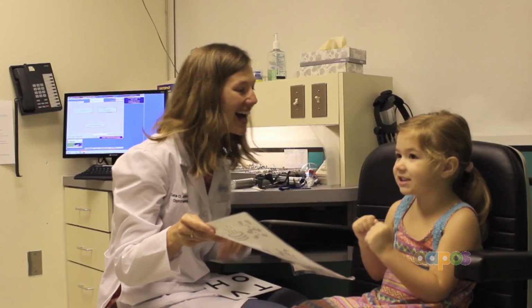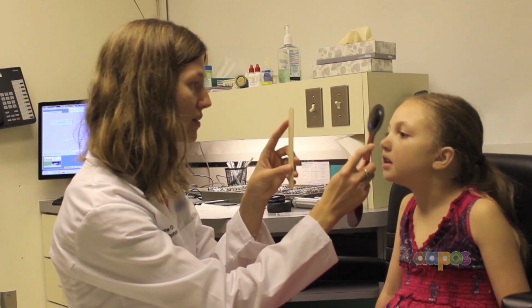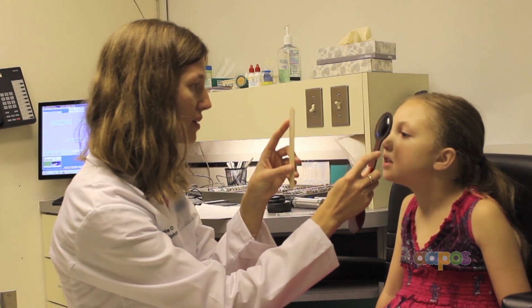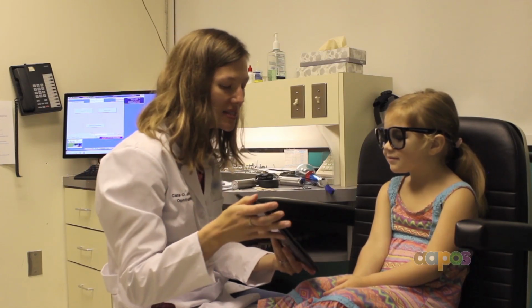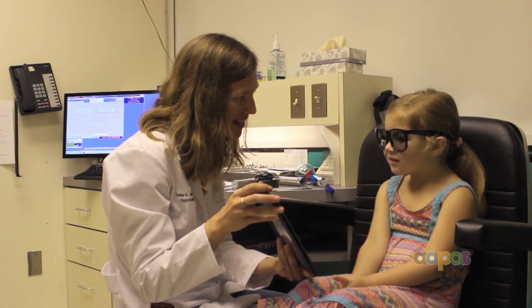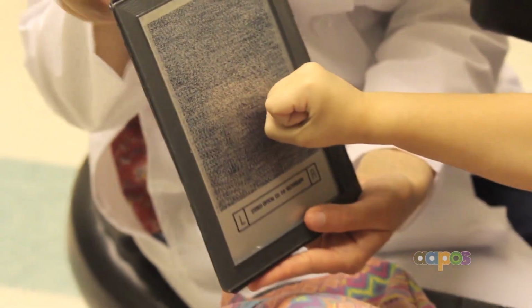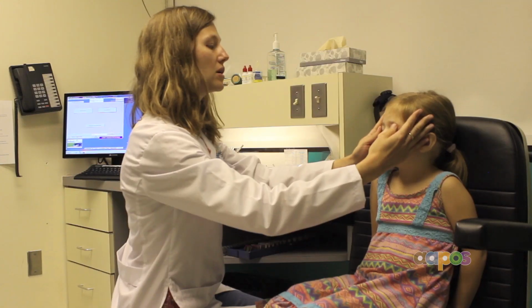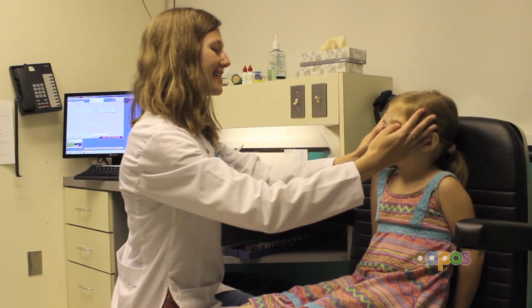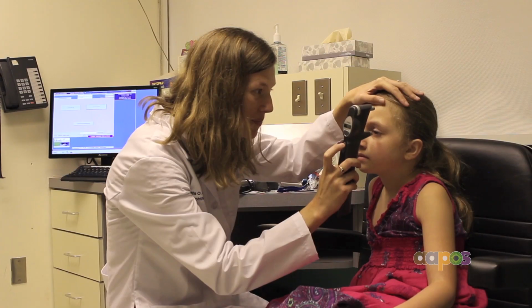This allows us to attach a number value to their vision and can happen as early as 2 years old sometimes. By alternate covering your child's eyes, eye movements and any misalignment are examined. This can be assessed in children of all ages. We also test stereo or 3D vision in verbal children. This gives us basic information on how your child's eyes work together. We can check eye pressure a number of ways. Some ways require eye drops to numb the eye. A special tool we use, the iCare, does not require drops and most importantly does not hurt.